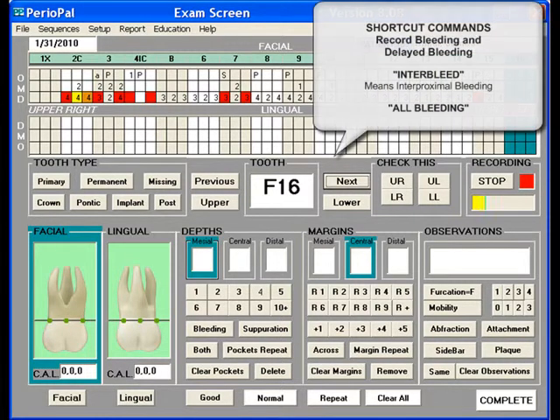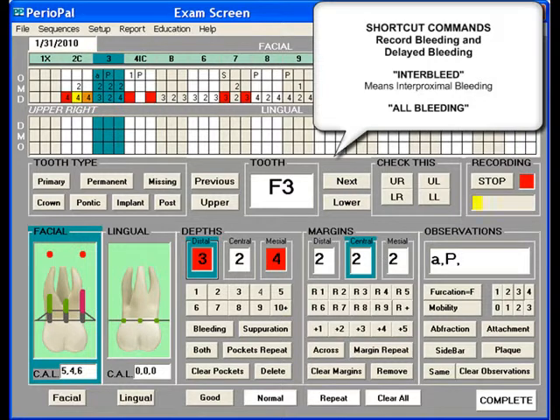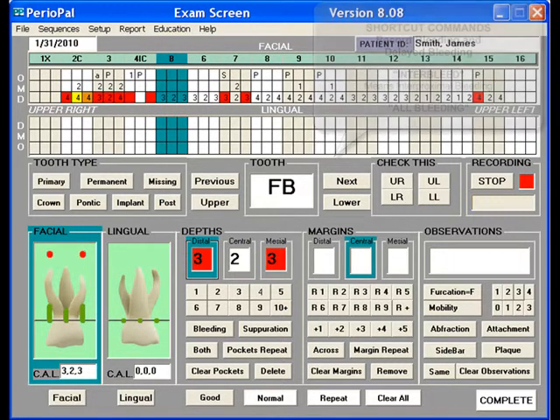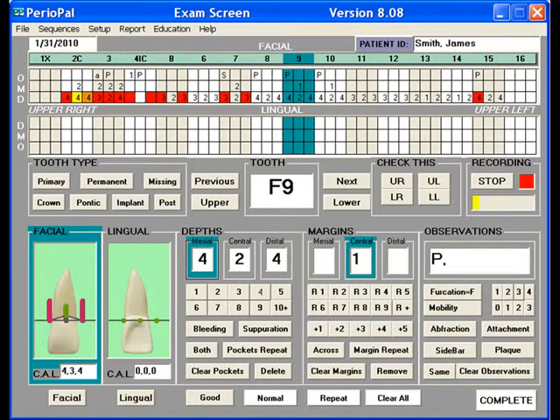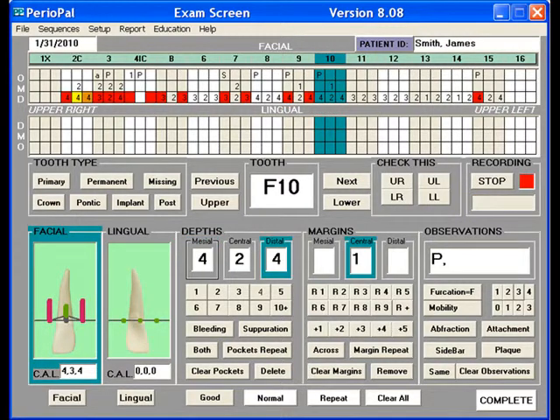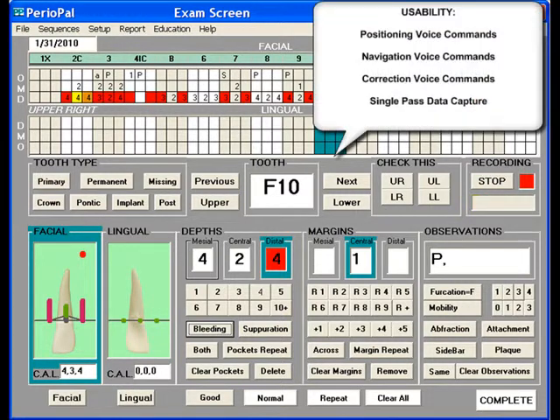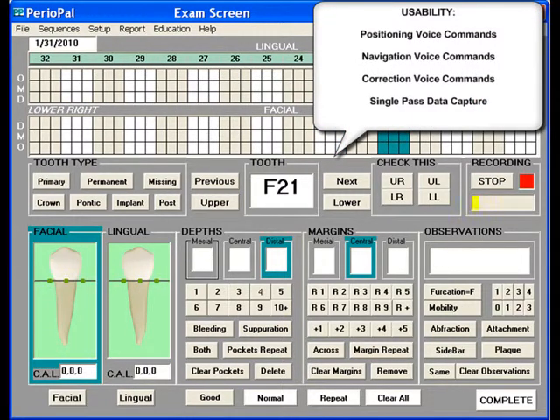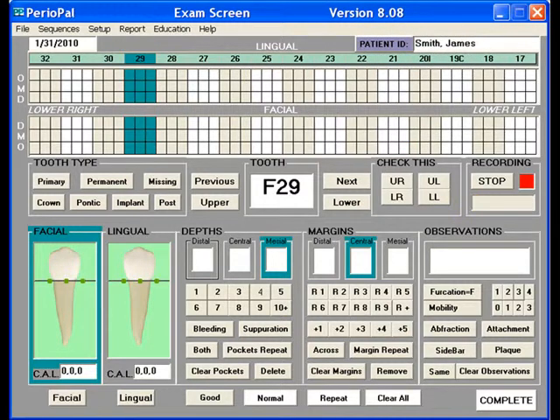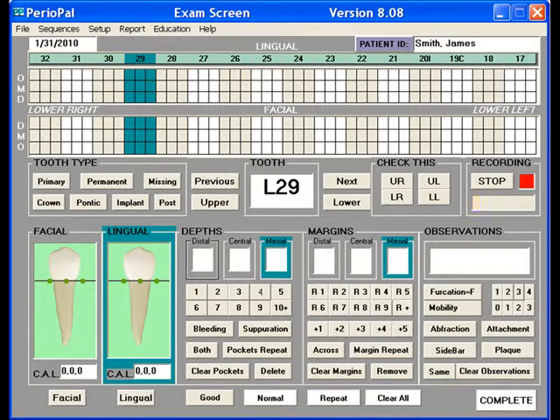Go. 3, all bleeding. Go. 5, interbleed. Go. 9, interbleed. Go, 10. Distal. Bleeding. Go. 21. Go. 29. Lingual. Margin mesial. Margin distal. Central. Facial.